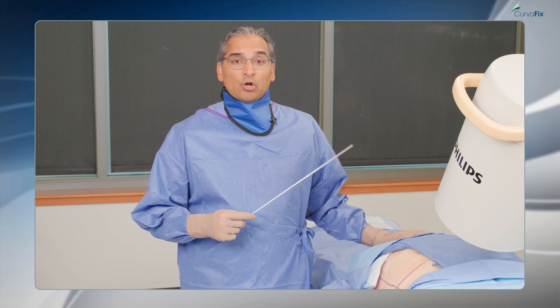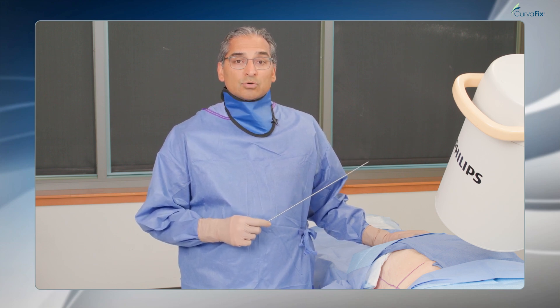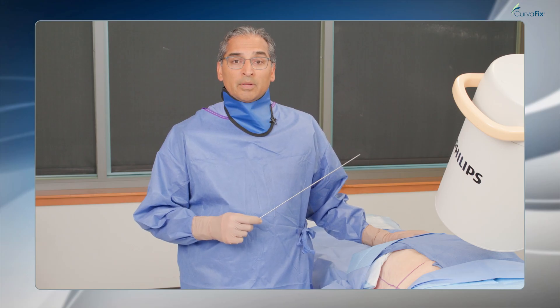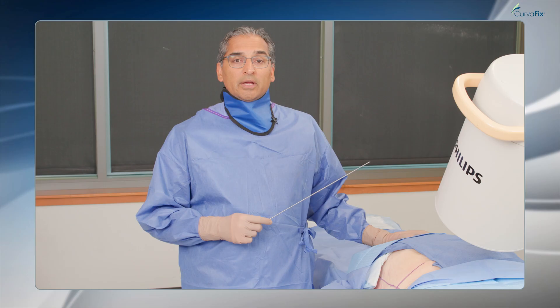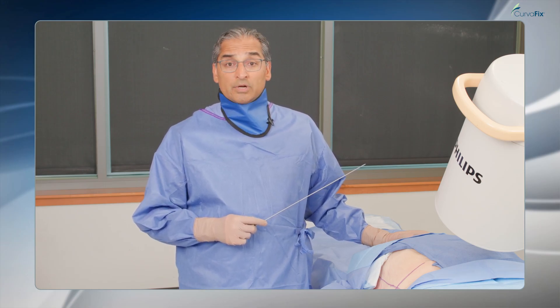By having a large diameter screw in the back of the pelvis holding that insufficiency fracture or insufficiency fractures, I can allow for early weight bearing as it confers good stability in poor bone quality. In this scenario, we'll be putting a screw in the back of the pelvic ring in a non-dysmorphic pelvis, doing this transsacral transiliac.